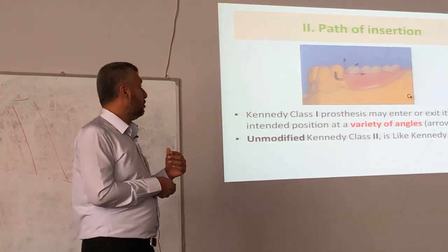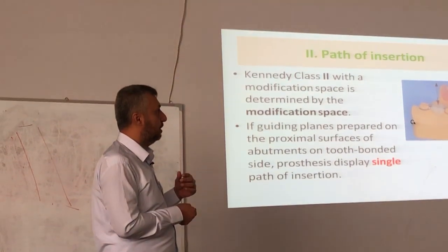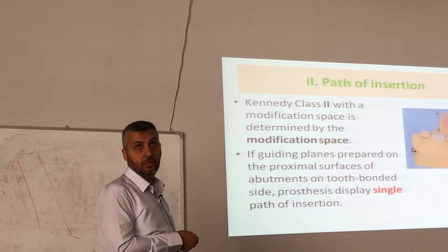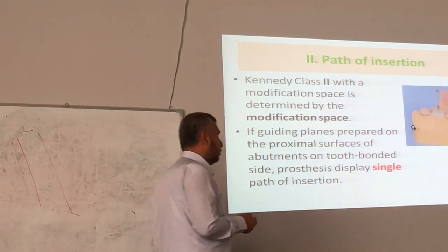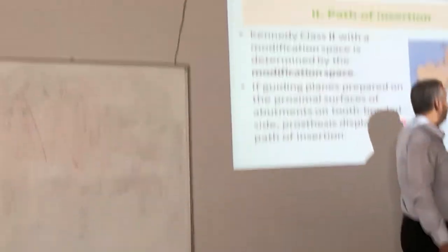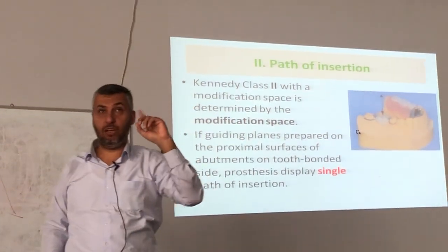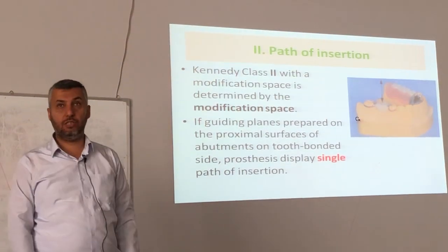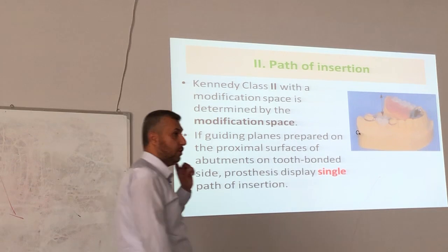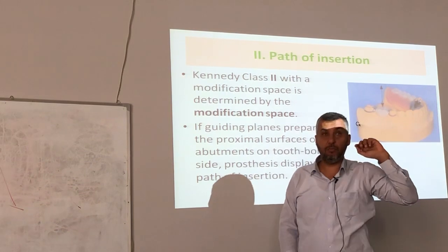But in case of modification, this is class 2 mod 1, unilateral. In case of modifications, listen to me on this: the modification determines the path of insertion. In case of modifications, the modification space determines the path of insertion.